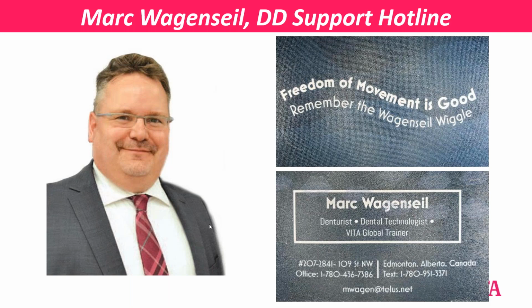Do you use a group function setup with your freedom concept? Yes, I still have working and balancing on the articulator. It's not knuckle tight. It has a little bit more freedom and fluidity in it because the chew cycle is anything but exact. So the upper cusps that I showed you and marked in red function within the lower fossa, and they work in balance within the lower fossa. So yes, I do provide some degree of working and balancing contact, but I'm more concerned about the hit and slide. I'm trying to just eliminate the hit and slide. Okay, awesome. Next question.